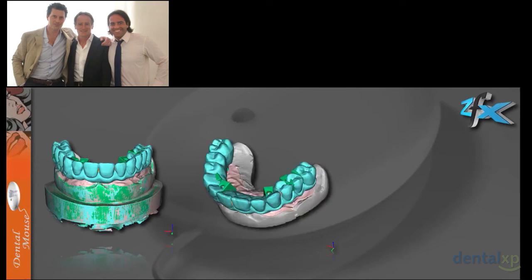You can evaluate from any perspective, from any point of view, so you can control and measure them more than once, and so you can be more precise, because after the cut part, you're going to send everything to the CAM that is really precise.